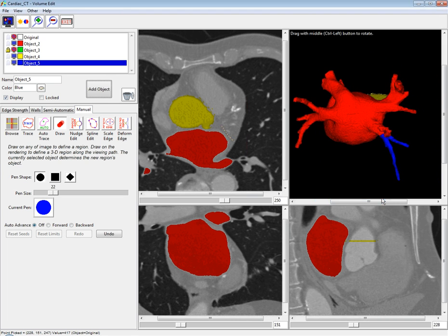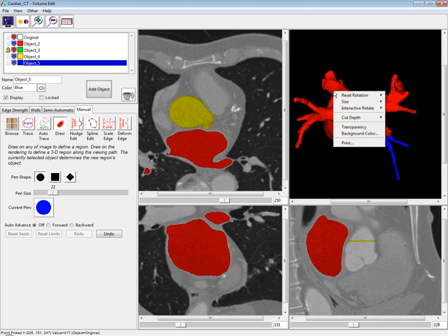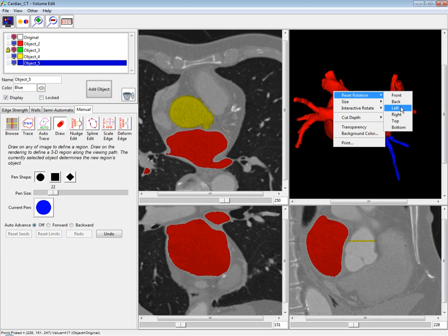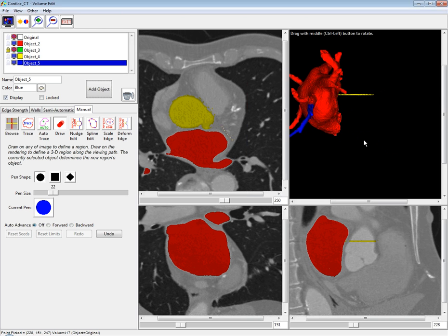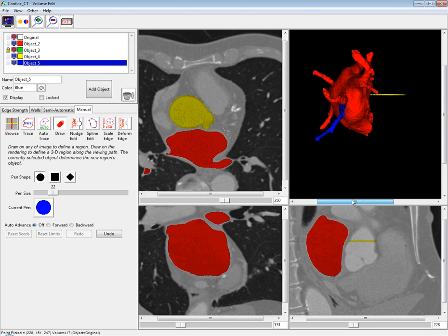Another new option in Volume Edit is in the right-click menu for the rendering. If you right-click, you can choose to reset rotation, and now you can choose to reset to the front, back, left, right, top, or bottom. It will go immediately to that standard position.